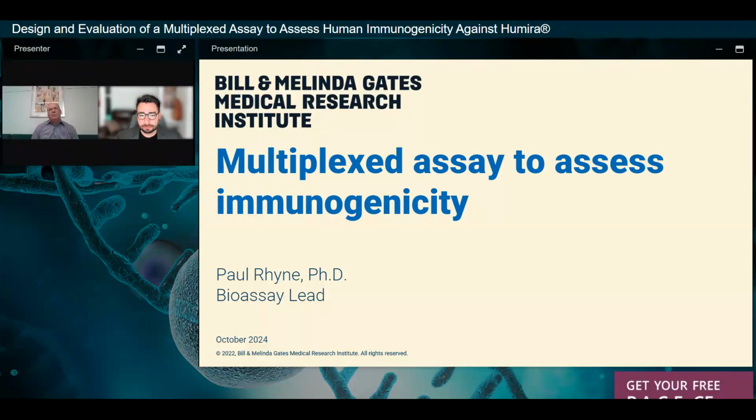Yeah. So I think what you have to consider is the industry is fixated on these single assays and this tiered approach, because that's the way it's done. That's what the regulatory agencies have seen, and that's the way everybody's been doing it. What we're trying to do is to open up your minds in that you don't have to do these in a sequential manner. You can multiplex these, and you can get data faster and more efficiently.